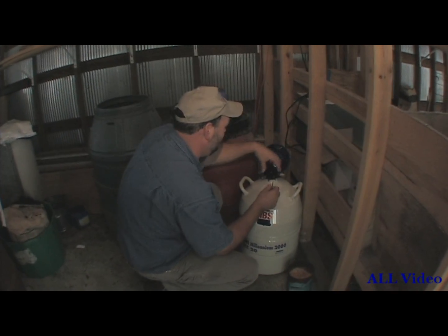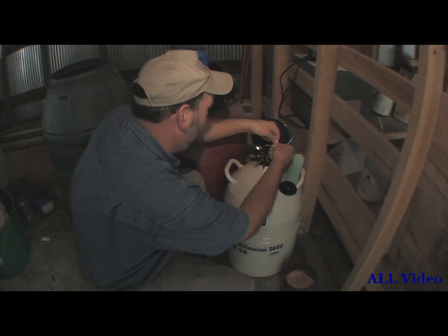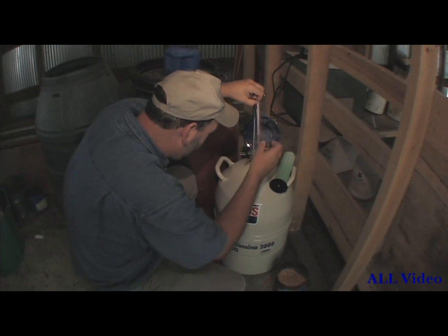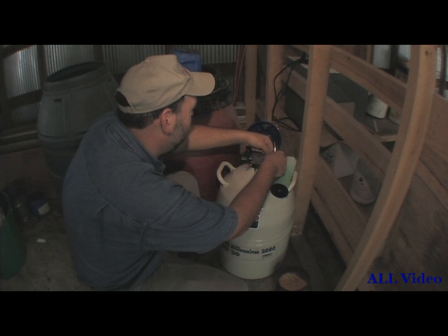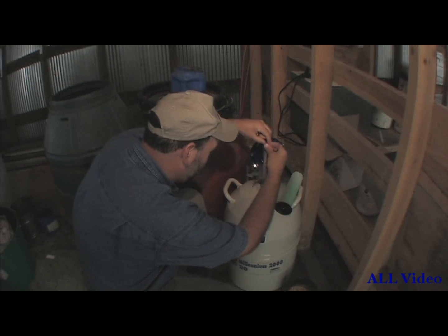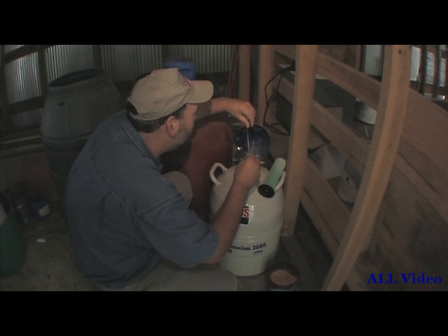All right, we're going to get the semen out now. Pull this out here. There's my straw holder and there are my straws. None there — I thought they were. Try this one. There's my straw holder, a pack full of straws. Get one out of the bottom right here. Put that back in.